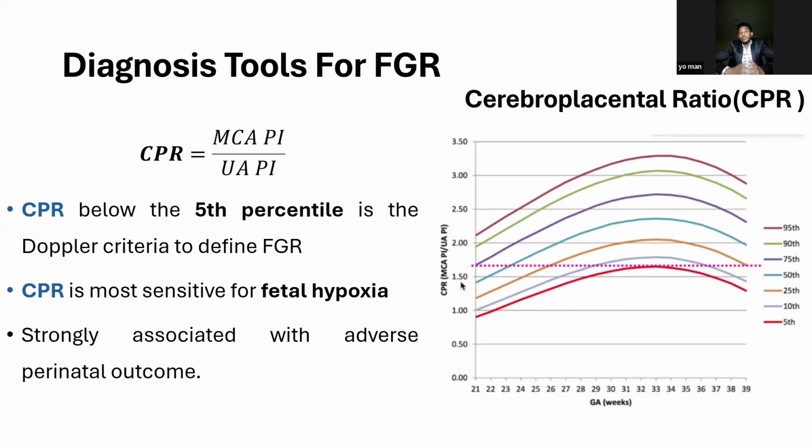That's why it's the best tool for Doppler diagnosis of FGR, because when FGR strikes, especially in the late phenotype of FGR, CPR might be the only chance to be altered early, okay? Because the time it takes for changes in late FGR is as rapid as anything possible.